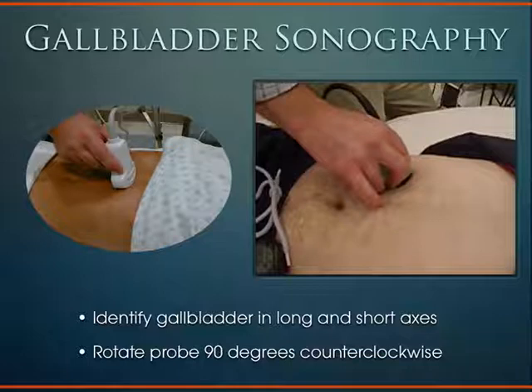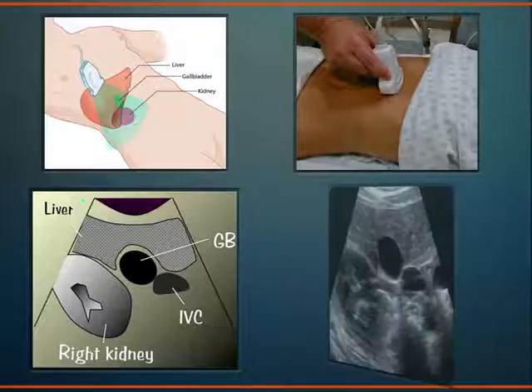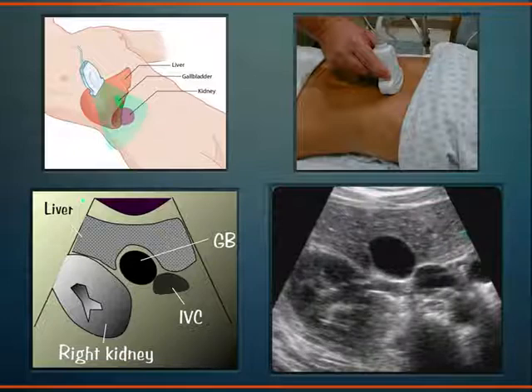And so it's really two views, and that's the idea in all of ultrasound, is to view things in two separate planes and then recreate that three-dimensional anatomy in your brain. That's the trick to all of ultrasound. Here we are on the transverse plane, and we've got a lot of circles on the screen.